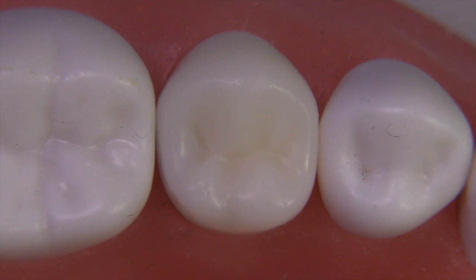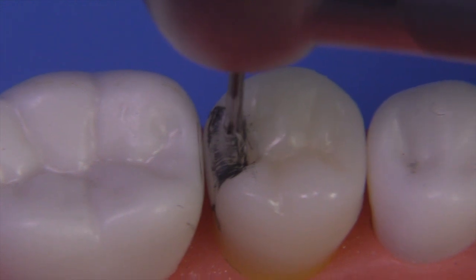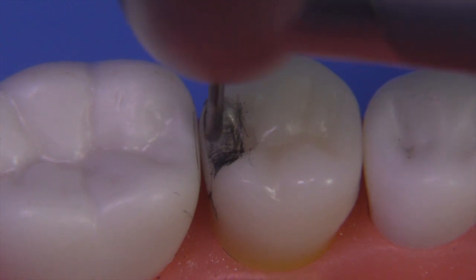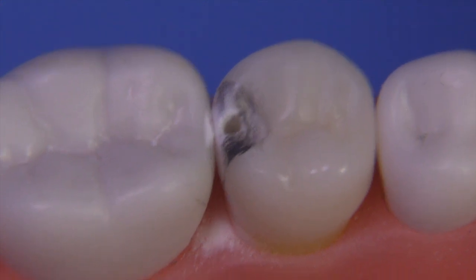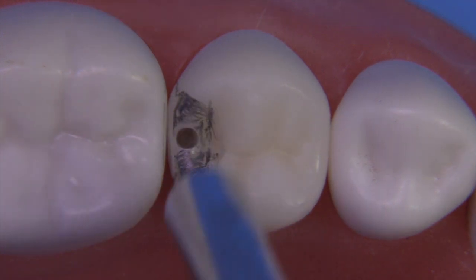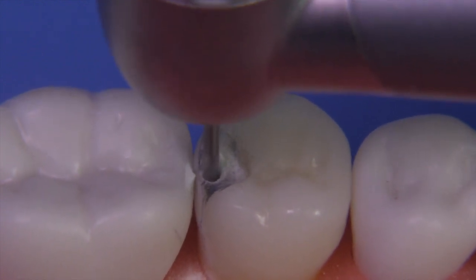We're going to prepare the composite first, then talk about what the composite finished prep would look like, and then move on to the amalgam. This is a 245 bur and we're going to start the preparation right in the middle of the marginal ridge, just working our way down until we get close to breaking gingival contact. This tooth made by Acadental is very hard and brittle on the outside — you sort of drop into the dentin, so maintain an excellent finger rest. Some might want to use a diamond, which has more of a gradual sanding effect versus a carbide.